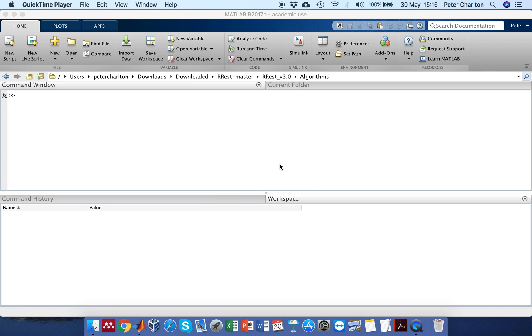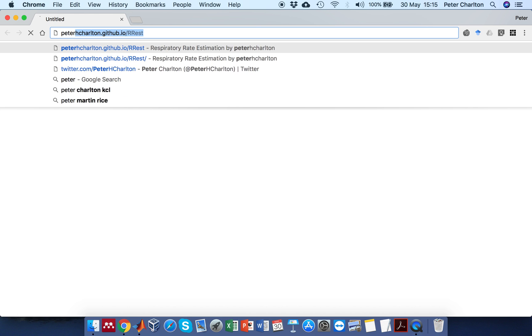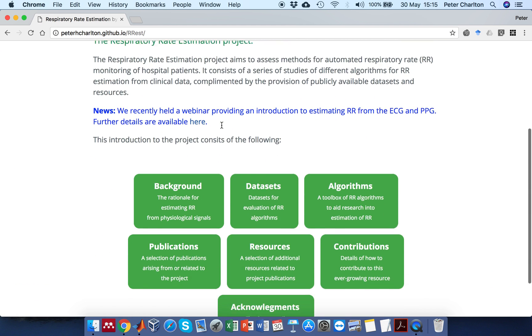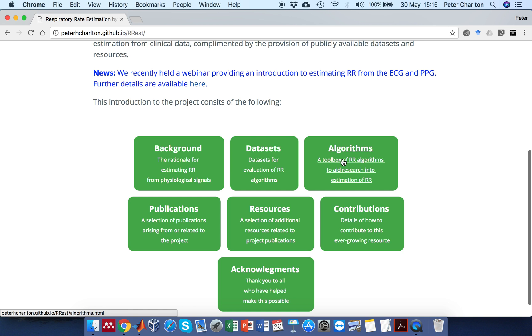I'll show you how to get started using the Respirituate Algorithms Toolbox. There are two items I'll use for this and both are available on the project home page. The first of these is the latest set of algorithms.